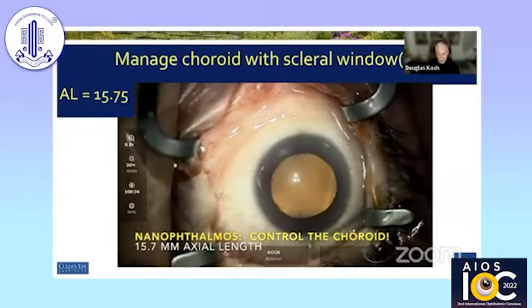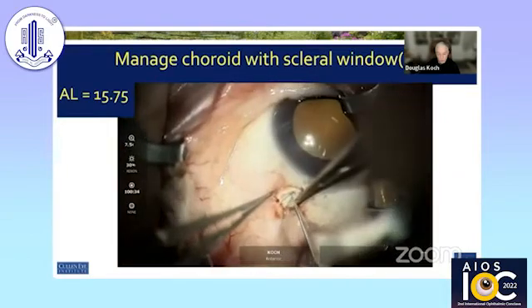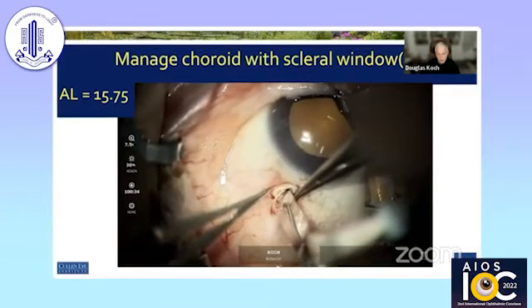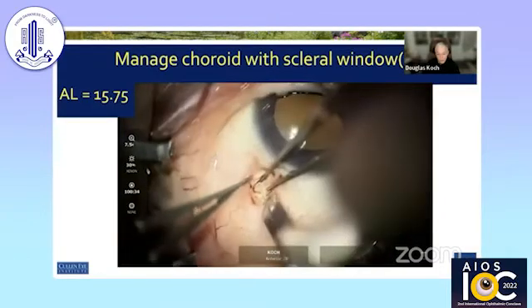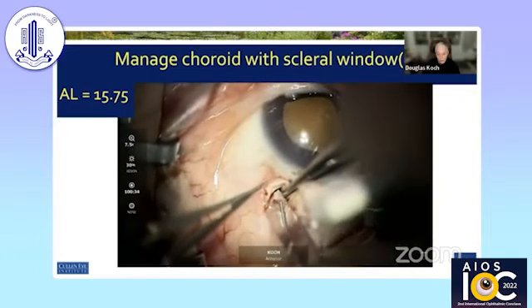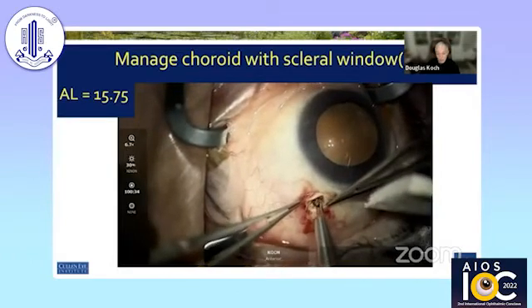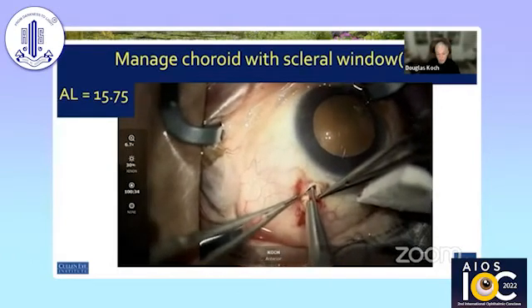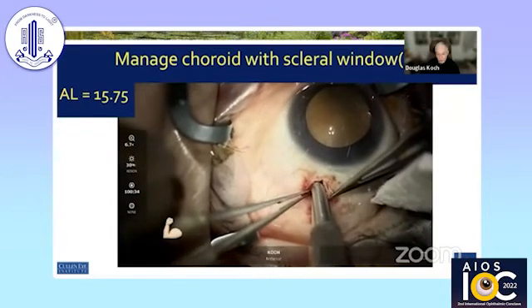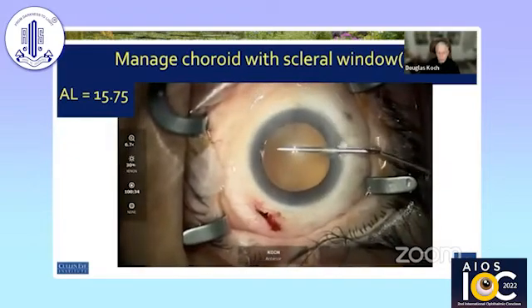You can make the scleral window with a single slit or a scleral flap — making it very thin as the window itself, or using a Kelly punch. Here I am with my colleague Peter Chang in a 15.75-millimeter eye making a scleral window. You can see how thick the sclera is, and it really takes a lot of force with a Kelly punch. With that, in this patient, the surgery went well.